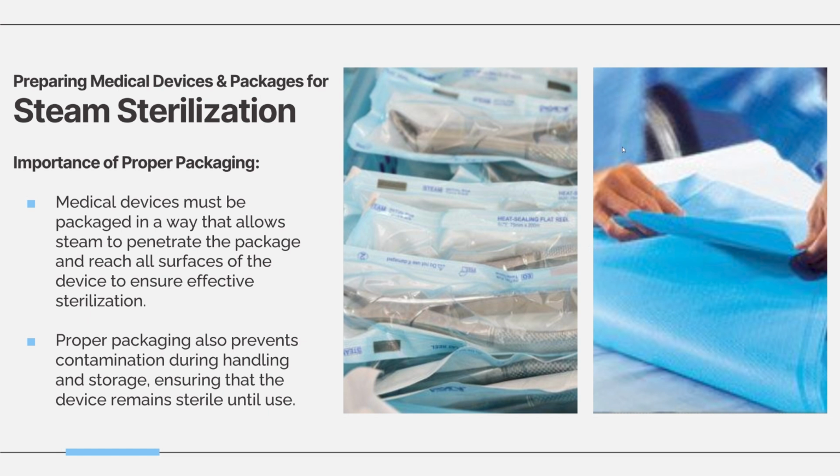So if it's wrapped too tightly, there's no way for sterilants to go through it, especially with the wrapper techniques. So you actually have to make sure it's not wrapped too tightly. And for that reason, you have to make sure it's not wrapped too loosely either, because if it's wrapped too loosely, you're more likely to unravel the package if you were to touch it.